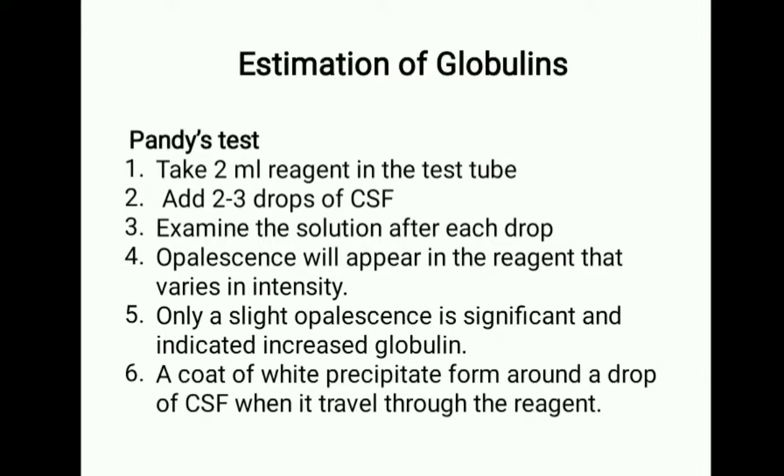Only a slight opalescence is significant and indicates increased globulin. A coat of white precipitate will form around a drop of CSF when it travels through the reagent. The solution will become turbid.